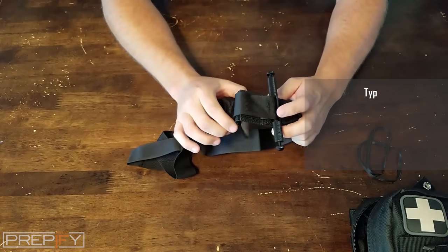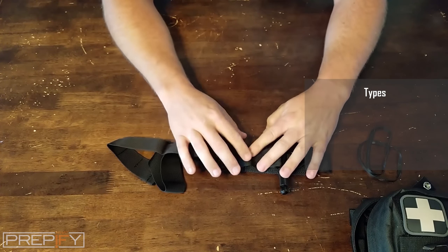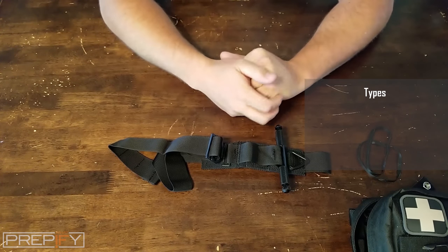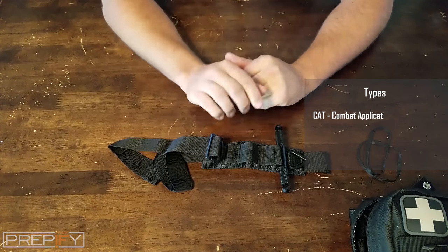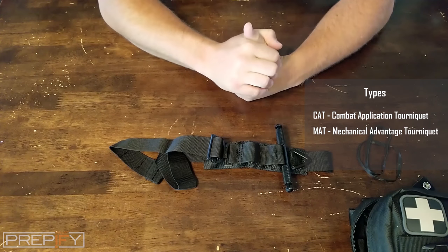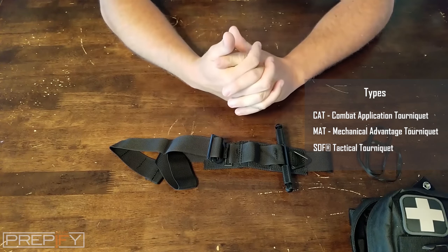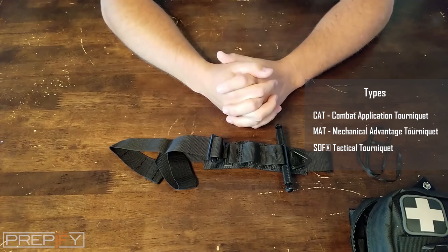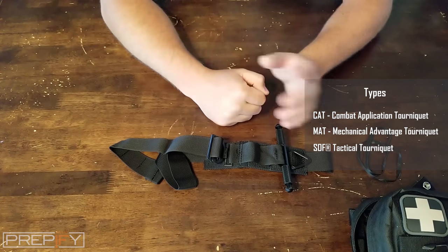There are several different types of tourniquets out there. Stay away from the airsoft ones — those are not reliable. The real ones are a little more pricey, but when you need to save your life, you want something worth the cost. This one is called a CAT. Others include the MAT, which is a Mechanical Advantage Tourniquet, and SOF tactical tourniquets. If you're going to keep one in your IFAK kit, make sure you practice with it.